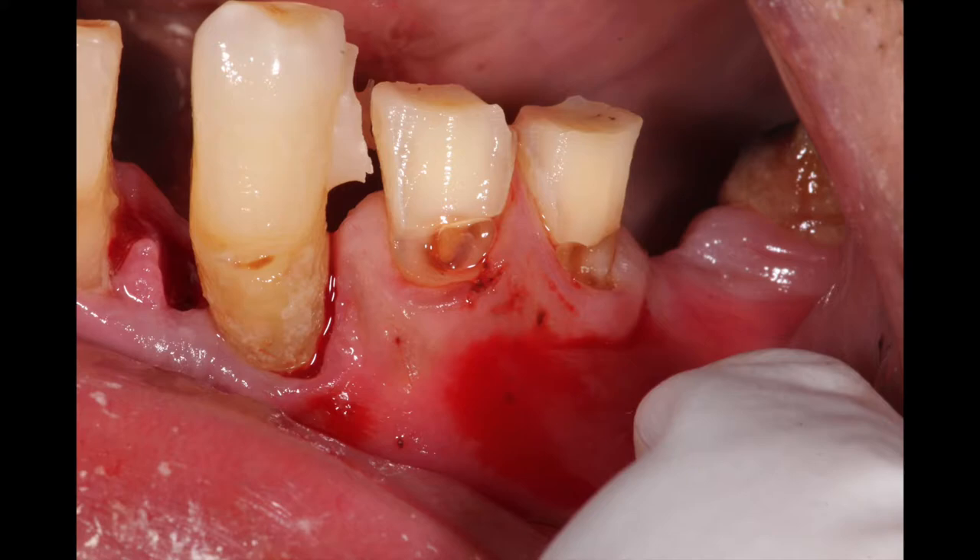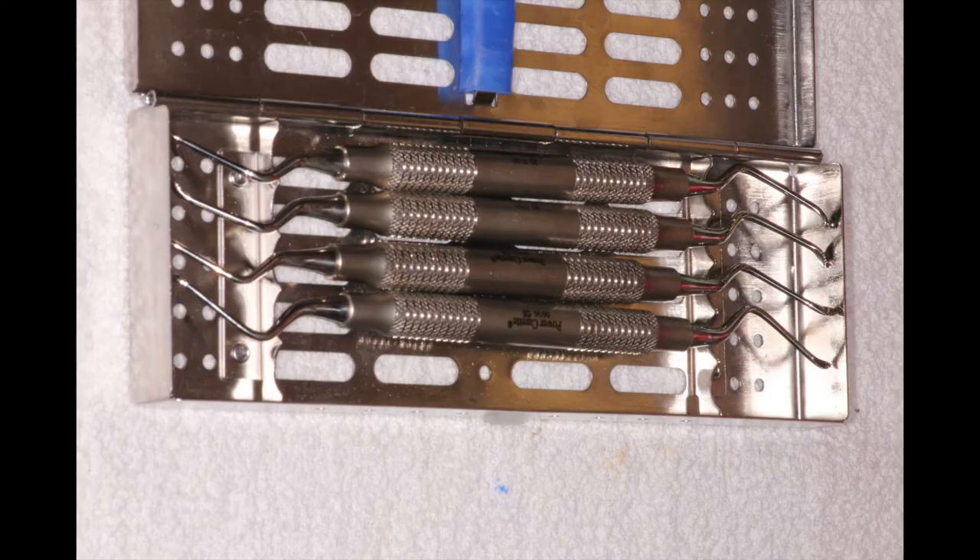After that, we went ahead and removed the decay that was along the buccal surface of teeth numbers 20 and 21, then went on to do the rest of the preps of the other teeth, and lastly extracted the remaining two teeth. After we did the extraction, there was quite a bit of soft tissue down inside the socket, so we used these curettes.